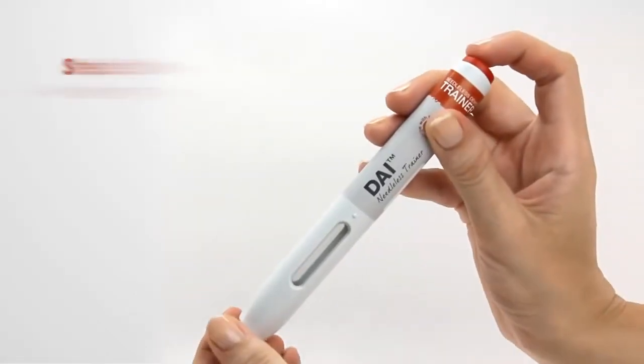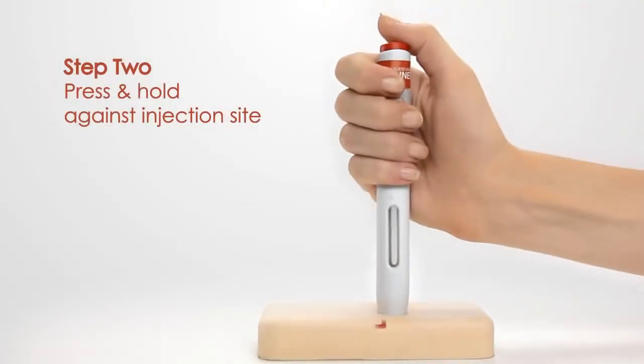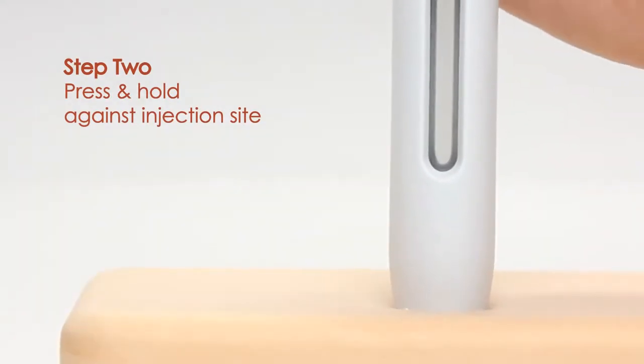Step 1: Remove the cap. Step 2: Press and hold the device against the injection site at a 90-degree angle. The needle cover is pushed into the device, releasing the safety lock and enabling the injector to be activated.